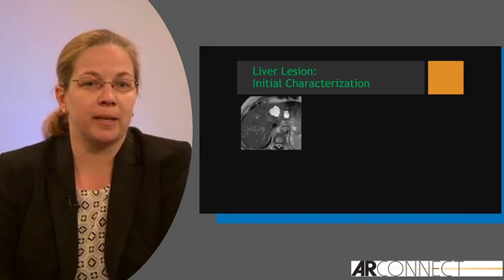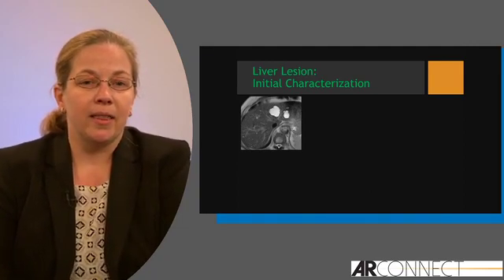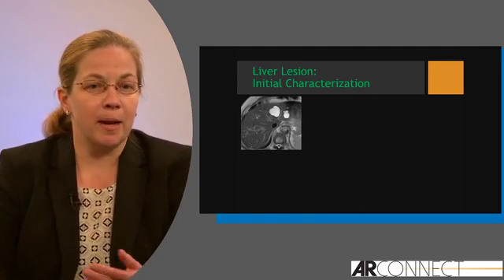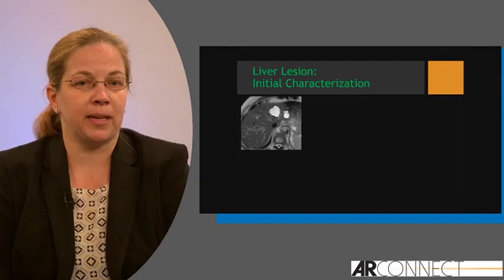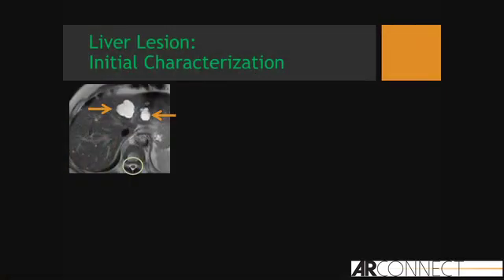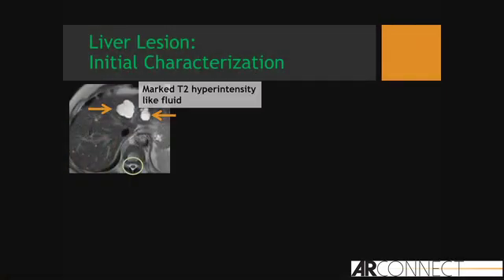When we look at our T2-weighted images, there is some information we can gather from T2-weighted hyperintensity. For instance, this lesion here has marked T2 hyperintensity that's like fluid, and so I feel comfortable calling this a cyst.